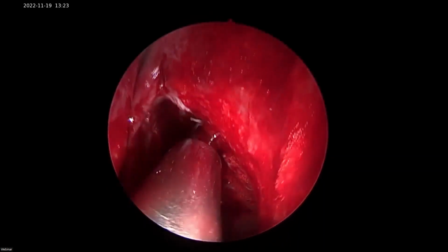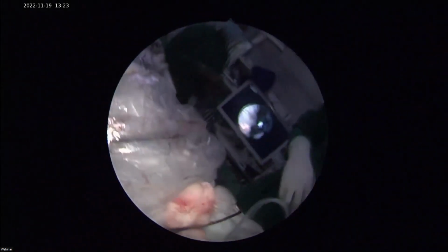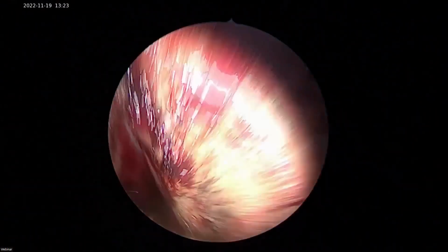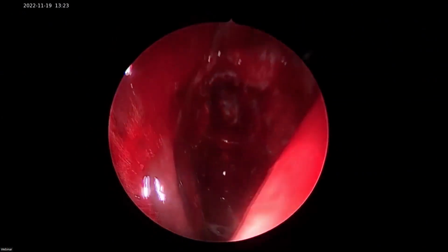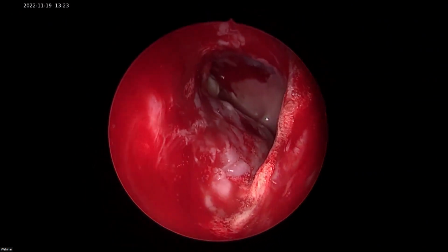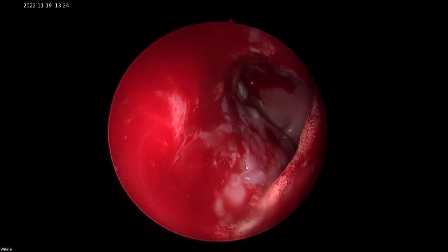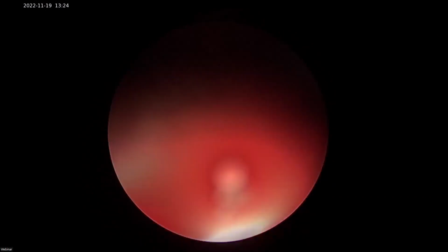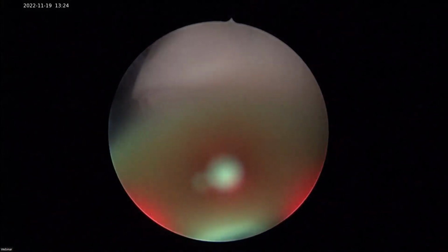Got something. Something has come out. एक काम कर, इसको section लगा दे and I will manage that. Blade बाहर निकाल और उसको section लगा दे. See, it has come, something has just dropped, I think. अभी वो 90 डिग्री क्यूरेट पे आ जाएगा. Now the flush may work, yeah.